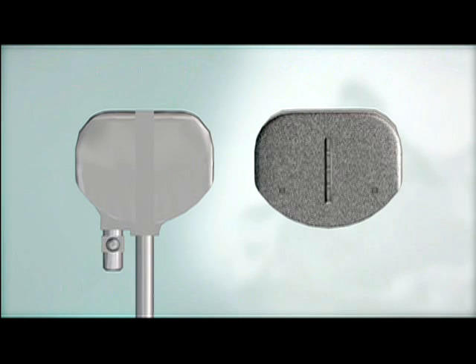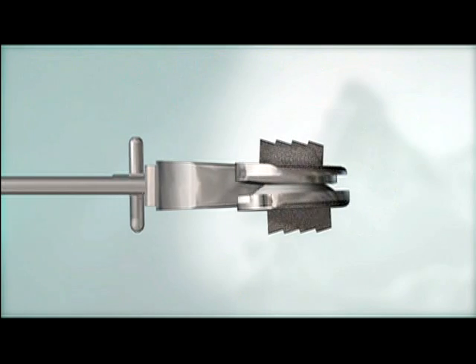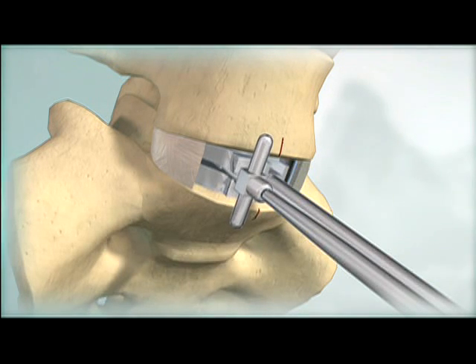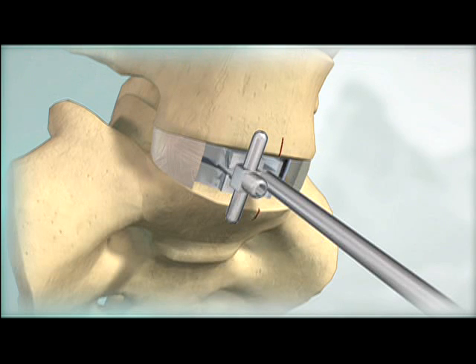Trial implants are used to determine the appropriate implant footprint, lordotic angle, and disc height. Advance the trial to the posterior margin of the vertebral bodies. The adjustable stop can be backed out to allow the trial to be positioned more posteriorly.